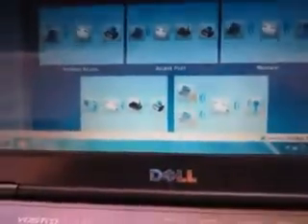Okay, we're lucky. Now we input the username. Okay, the same setup pages, but this time we are going to choose the network adapter working mode.